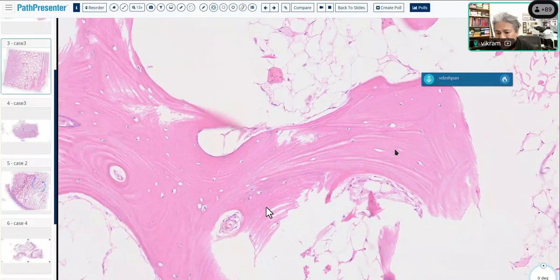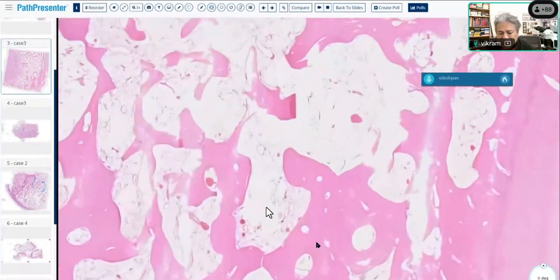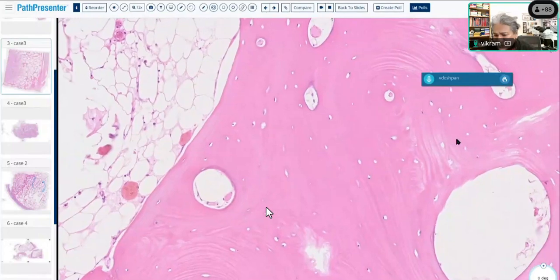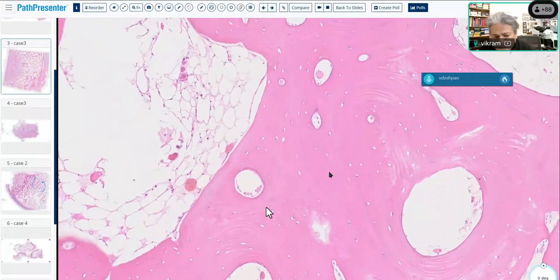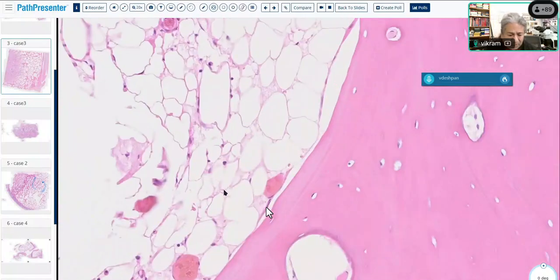case. So the osteocyte nuclei here are dropped out because of over-decalcification. You can imagine to decalcify this piece of bone, it took quite some time. And by the time we submitted sections, it was over-decalcified, and a lot of the osteocyte nuclei have eventually dropped out. I know this is not osteonecrosis because the soft tissue is alive. One of the first things to do when the bone dies is that the marrow dies, and the marrow to me looks alive with adipocyte nuclei, among other things.